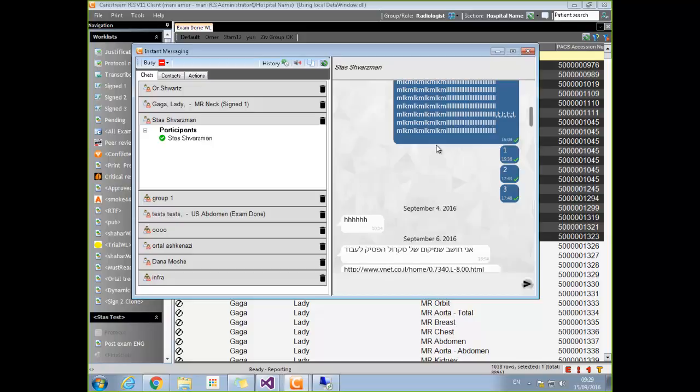For example, you want a whiteboard of all the events that happened today, or a modality has a defect, from 2 to 3 is not operating, or to send it to a group of all the technicians. It's a great technology, and we just need to change the GUI. We can use the same technology in a different application. Any other ideas are welcome.